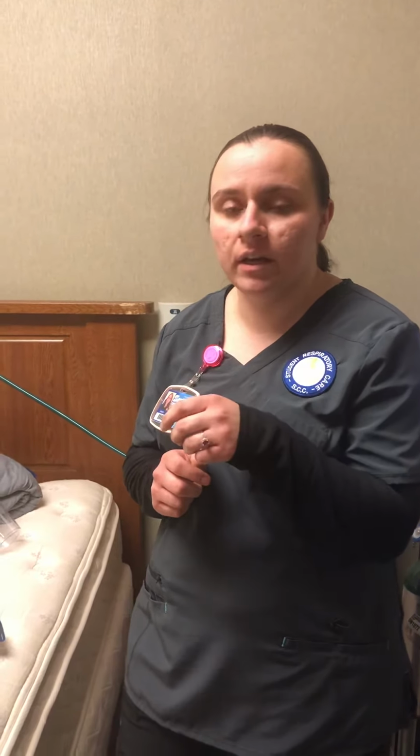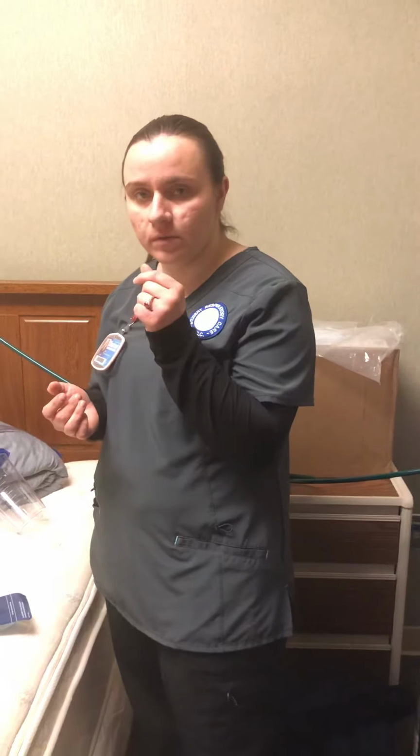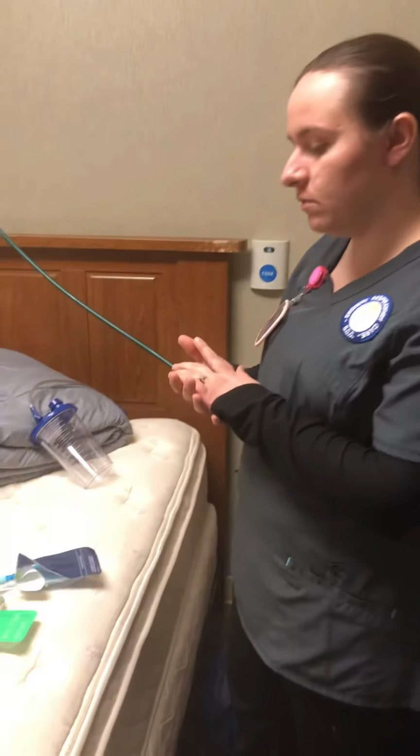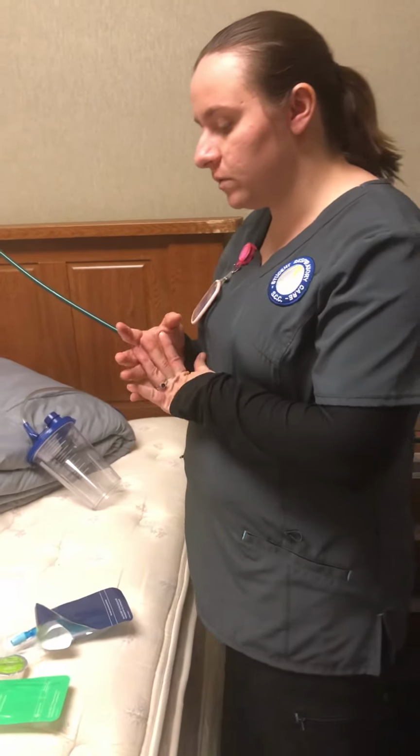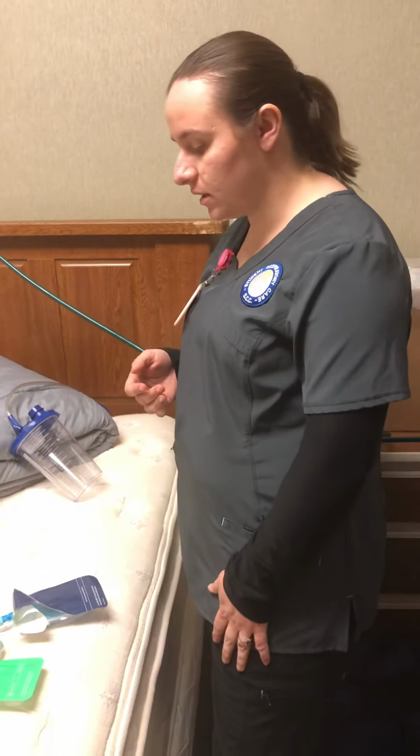and then I'm going to check the patient's ID band and get their vital signs, and also take note of the size of the endotracheal tube, and also take note of where the tube is placed. So when doing a cuff management, you always want to do a cleaning before you do your cuff management technique.